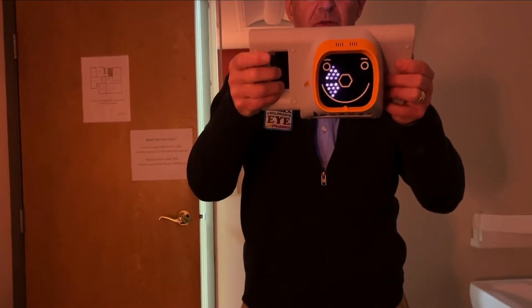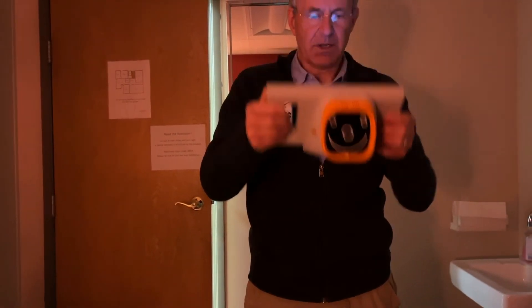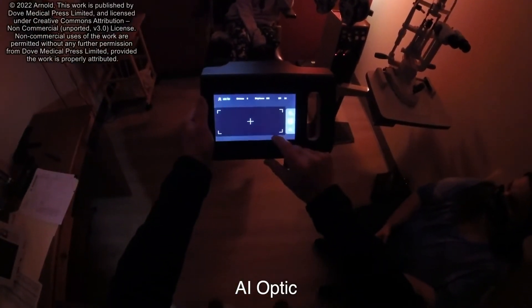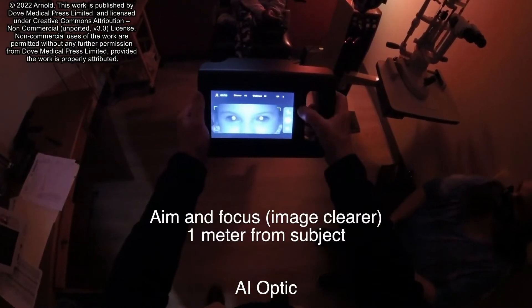You can look right at it. Look right at that. Perfect. That's a refer. When you look on this part, we push this little camera part like this, then I look at that part like that and it sees you.